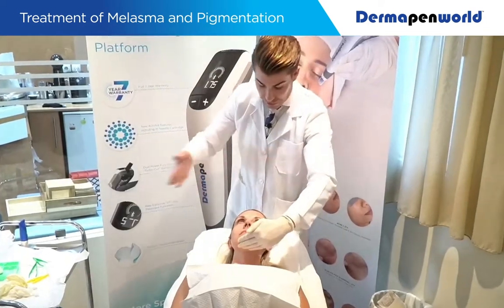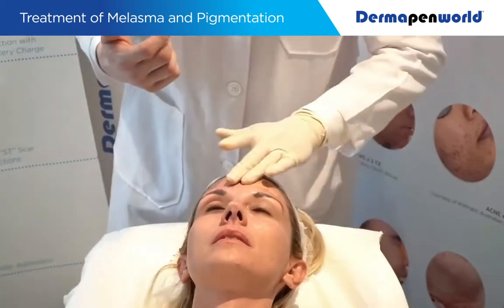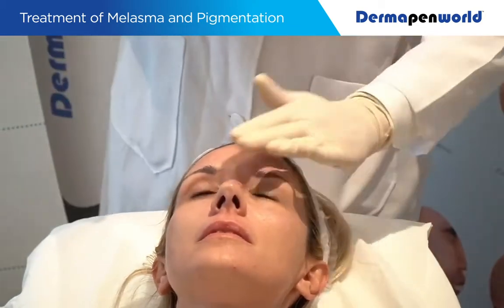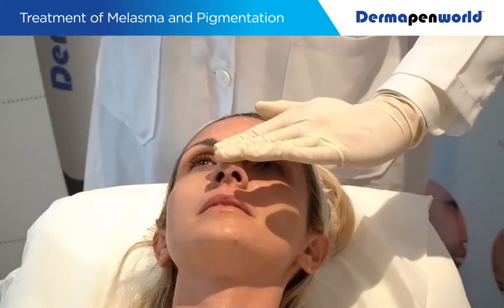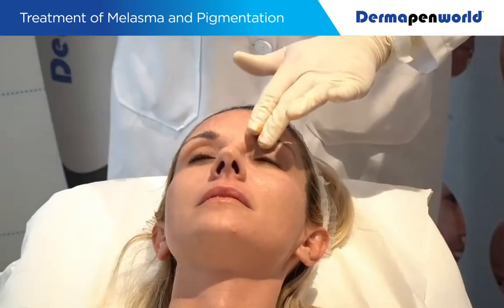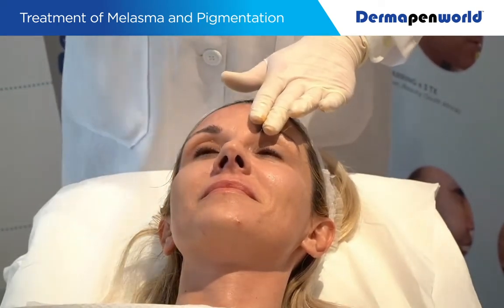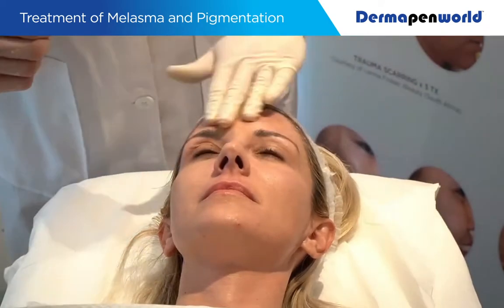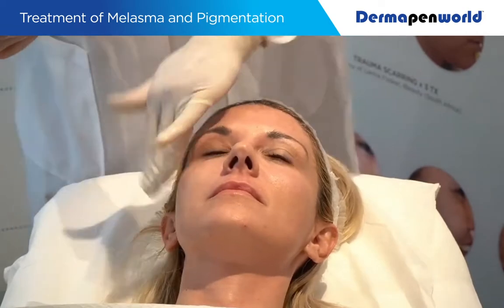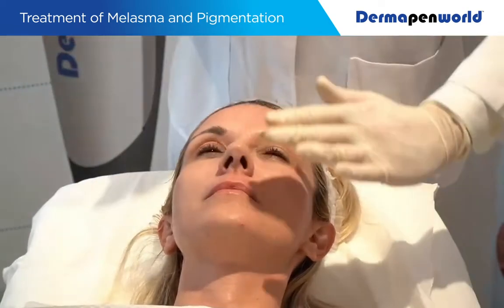And at the moment it should feel cool on the skin. The patient does not need to wash this off. So it means that the patient now leaves tonight and goes to bed in this. If the patient is a high-risk patient for doing silly things, get them to put another coat on tomorrow morning and just leave their skin. No washing required. Otherwise, the patient can do a very gentle wash with the Tri-Phase Cleanser using their post-op kit, and then apply Vitamin Rich Repair, and then some more Cover Recover.